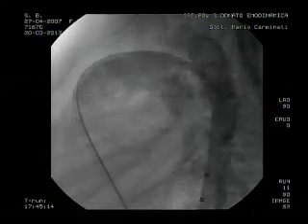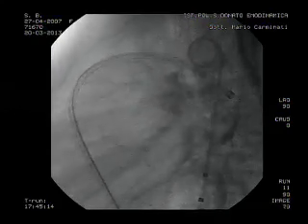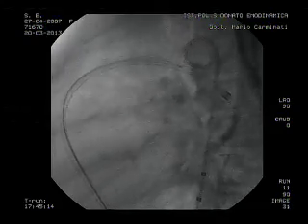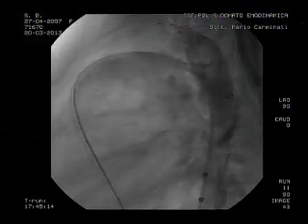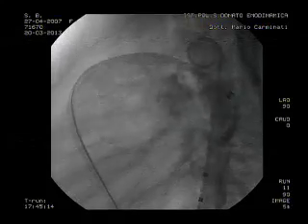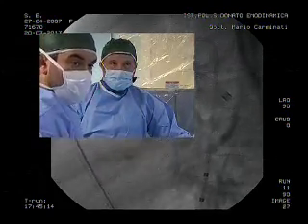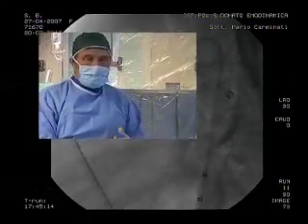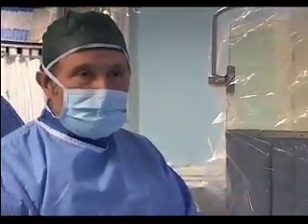Well, another point is sometimes it's rather unpredictable to see the morphology of the duct where catheters, wire are inside. So it can modify a bit the morphology of the duct. Yeah? Okay, why don't we make a try here, just for educational purposes, I think is nice.